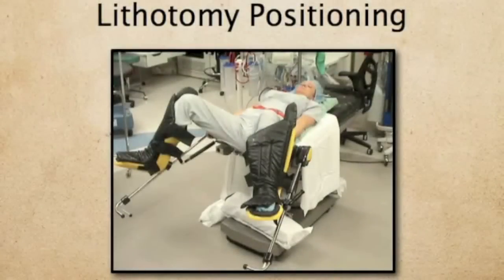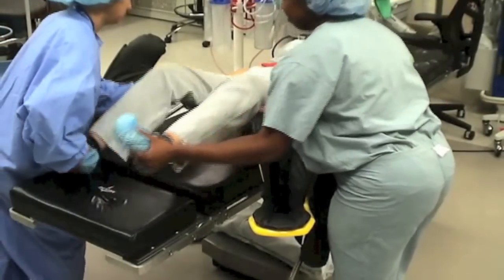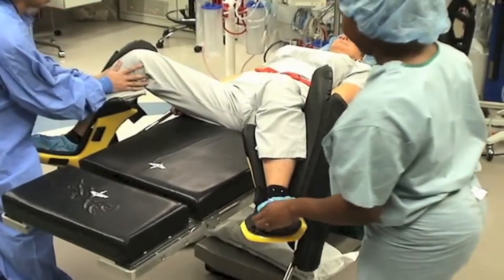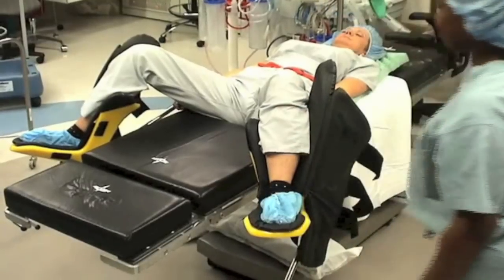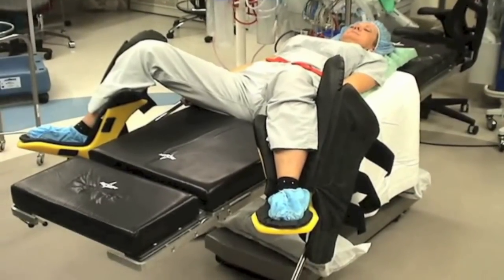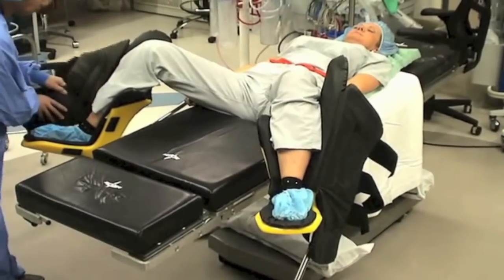Lithotomy positioning. The patient is positioned on the bed such that the buttocks is located within the groove between the head of the bed and the foot of the bed. The legs are placed within the stirrups simultaneously while lifting beneath the patient's knee and the patient's ankle.